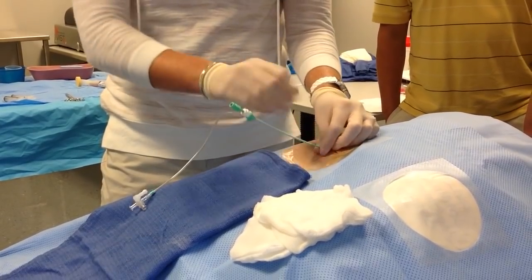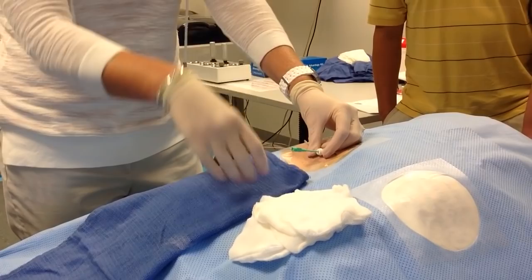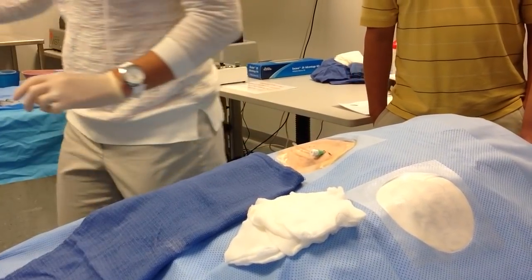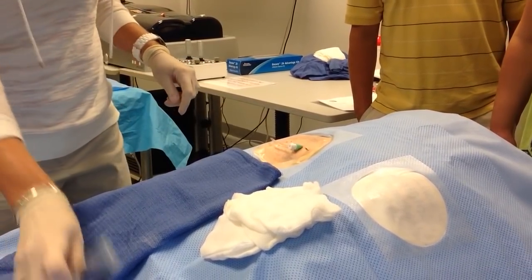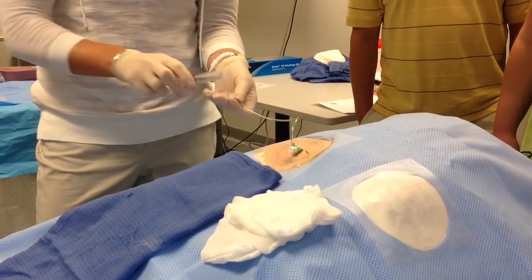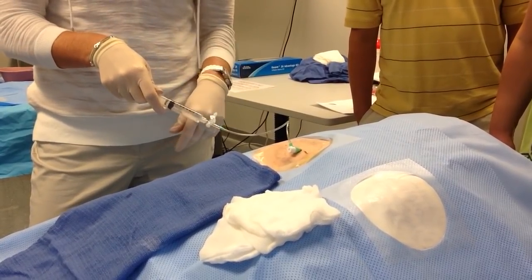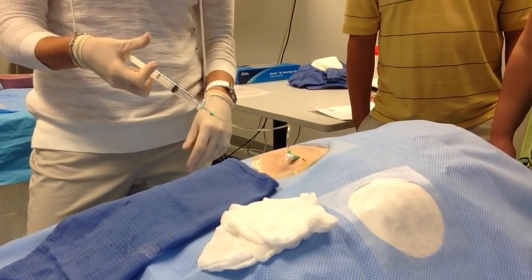You advance the sheath and the dilator. And then you take the dilator and the guide wire out together. Put that back here. So now you have your sheath in place. So then the physician would pull back. Now we're going to get air, obviously, because this isn't a closed system. But this would be blood. And then you flush that through.